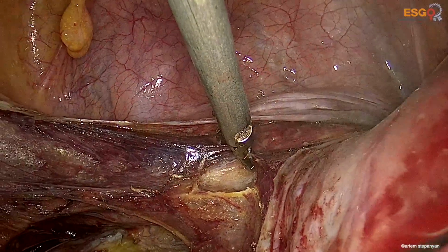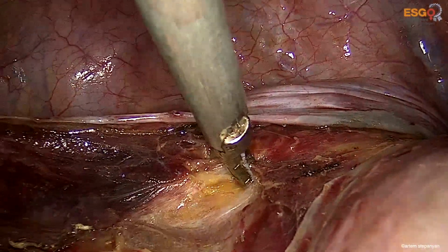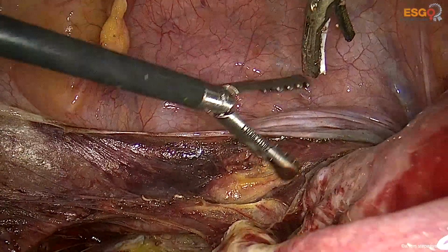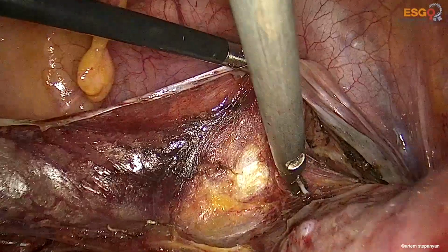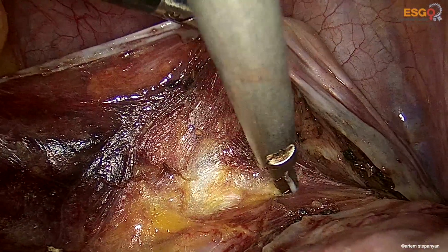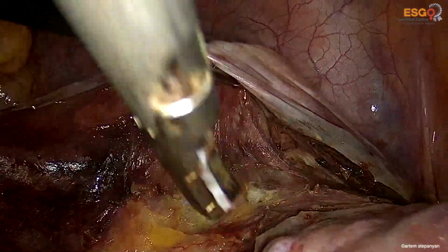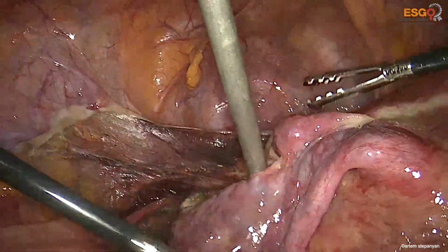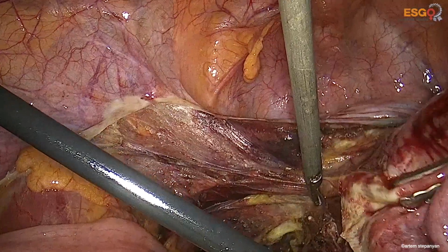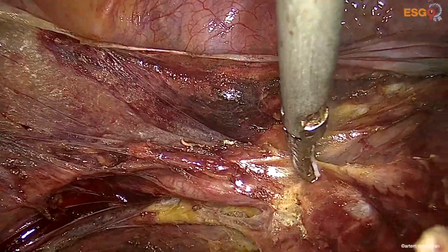Now we're dissecting the tissue surrounding the uterine vessels. So here the uterine vessels are identified.